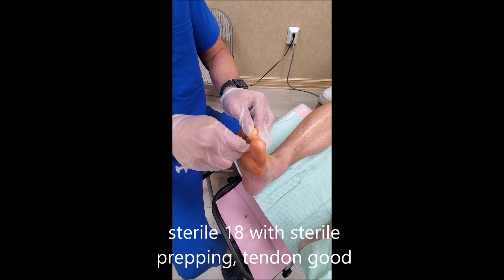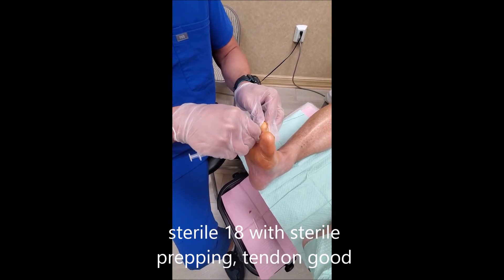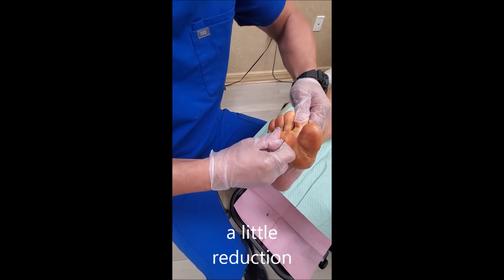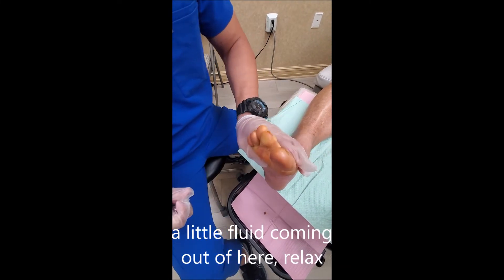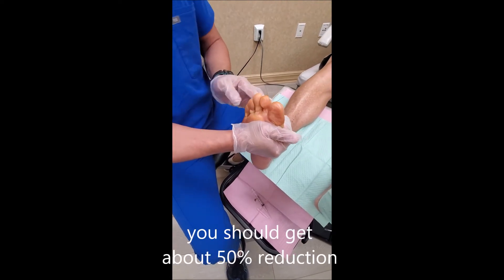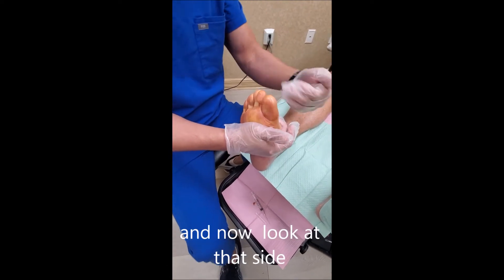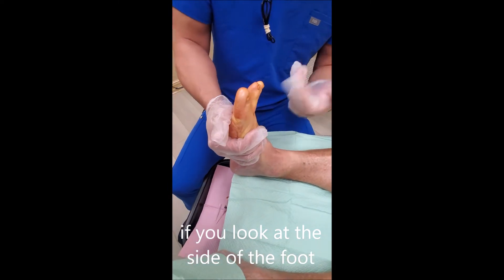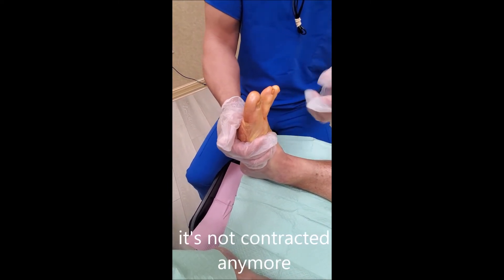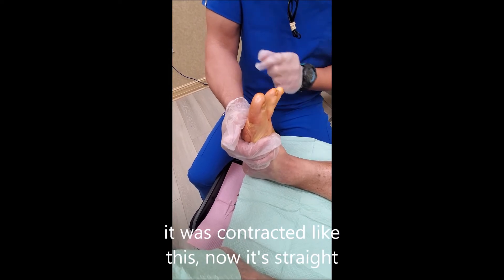Sterile prepping, tendon — good. A little reduction, a little fluid coming out here. We usually get about 50% reduction. Now look at the side of the foot — it's straight, it's not going down again, it's not contracted anymore. It was contracted before; now it's straight.